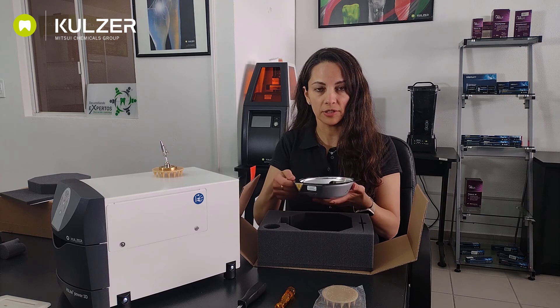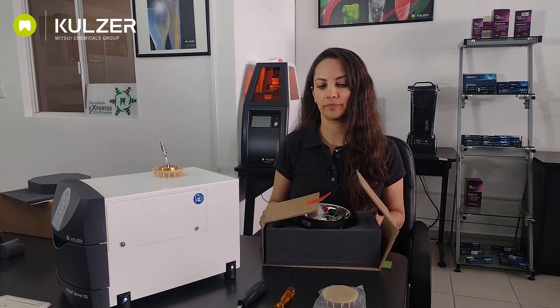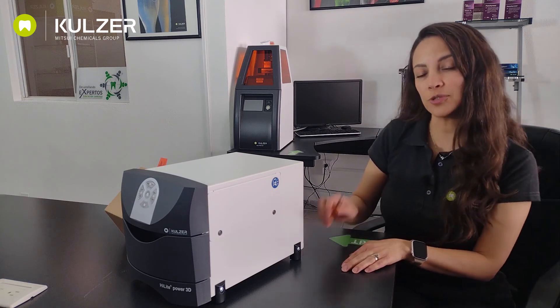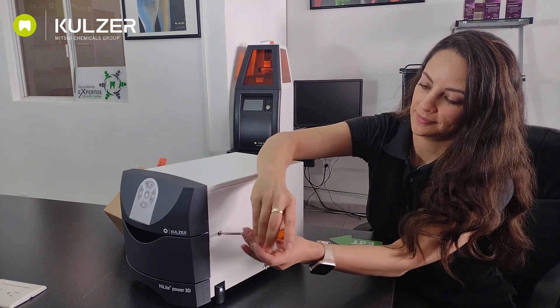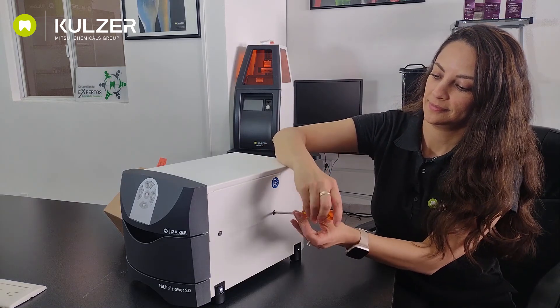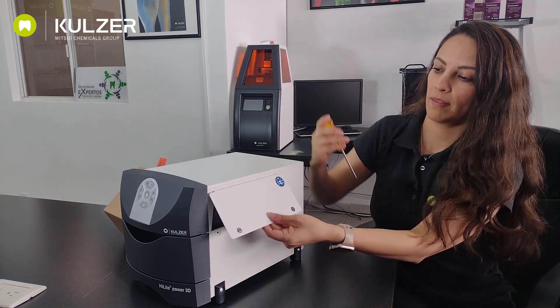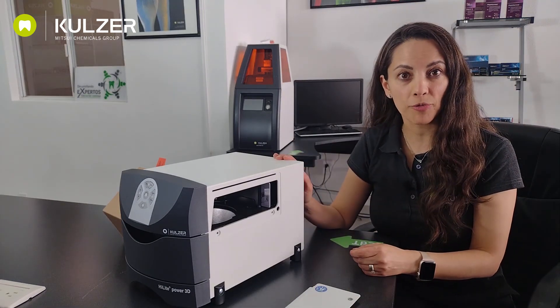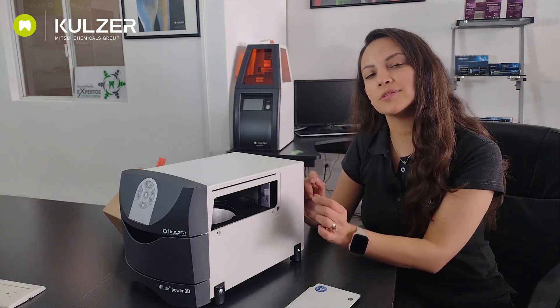To install the bulb and the filter we have to make sure that the device is not connected to the power outlet. Now we are going to install the bulb. First we need to use a Phillips screwdriver to gain access. To remove the door we need to lift it like this. As you can see, starting with the Highlight Power 3D model the chip card is already inserted — in previous models it had to be inserted manually. So let's first install the filter and the bulb.